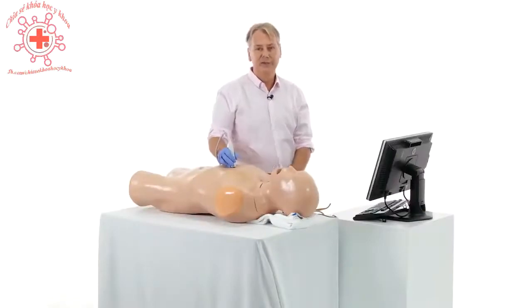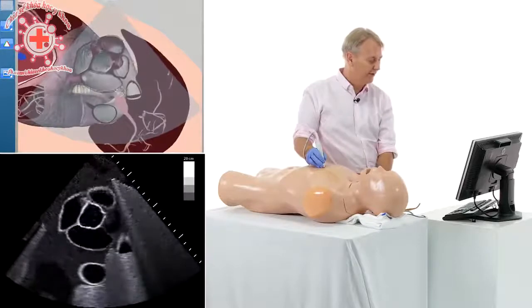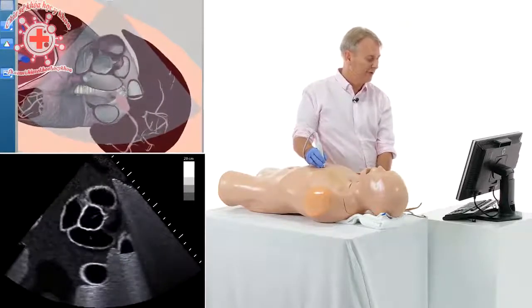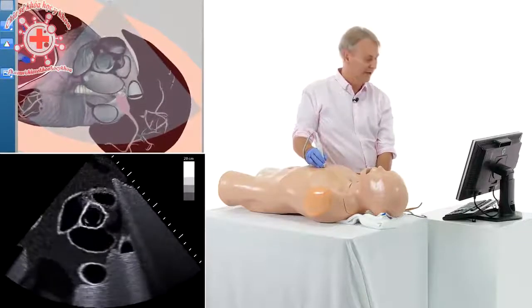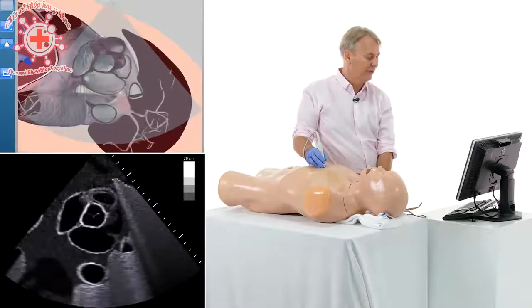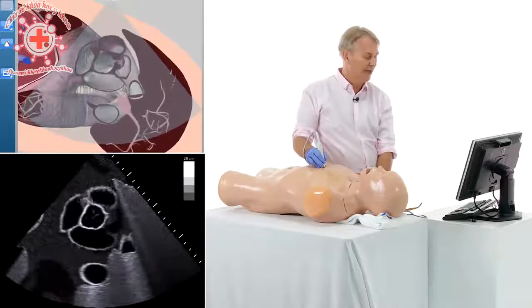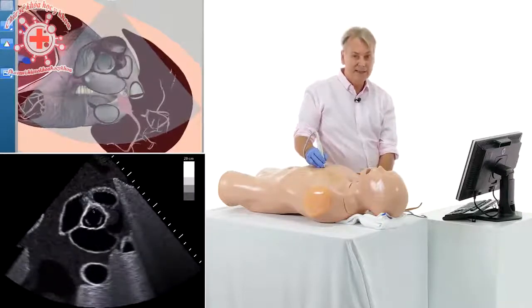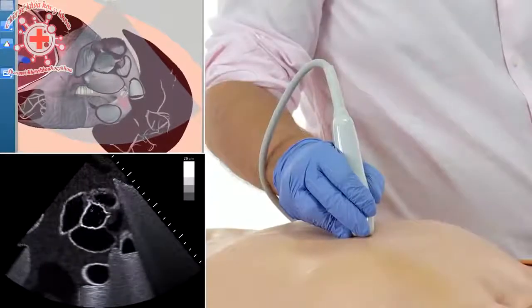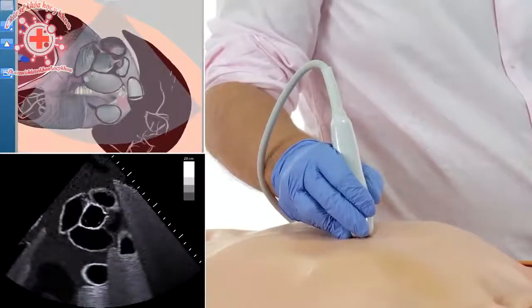Let's take a look at the short axis view on the simulator here and see how we can actually identify the different cusps of the aortic valve. Right here, this cusp, which is close to the interatrial septum, would be the acoronary cusp. The cusp which is close to the pulmonary artery is the left coronary cusp, and the one which is close to the right ventricular outflow tract is the right coronary cusp. And once you identify these cusps, it's also easy to tell which coronary arteries leave the aortic root. Here this would be the right coronary artery, and right here is the left coronary artery.